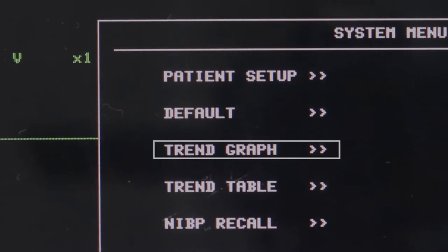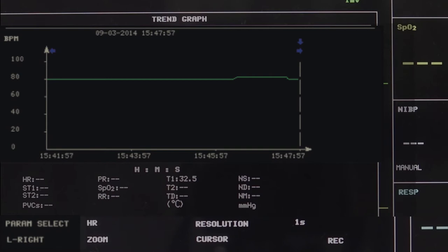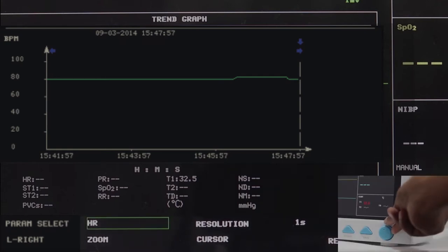Trend Graph: The latest 1 hour trend is displayed every 1 or 5 seconds and the latest 480 hour trend is displayed every 1, 5 or 10 minutes. You can pick a parameter to trend using parameter select below the graph.